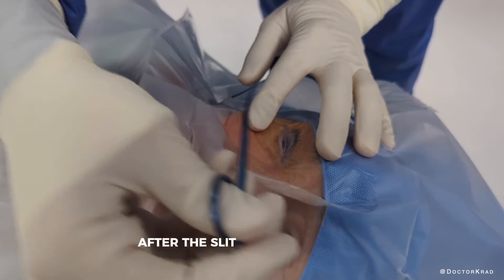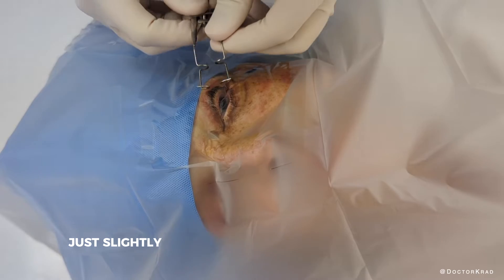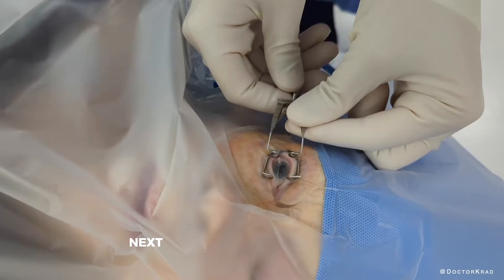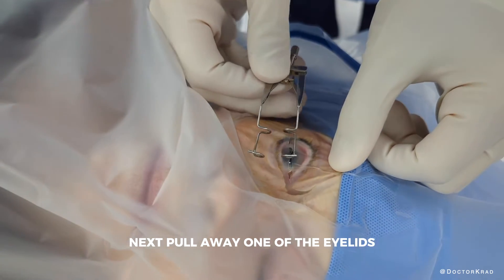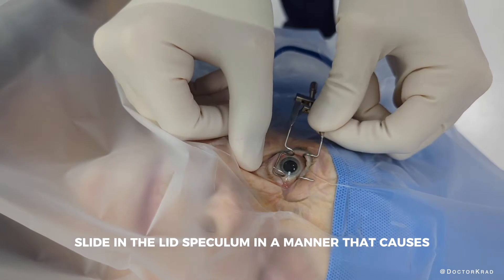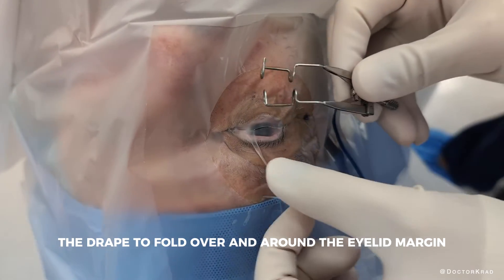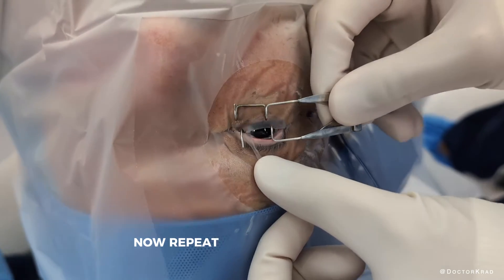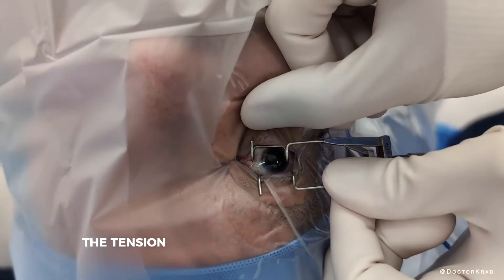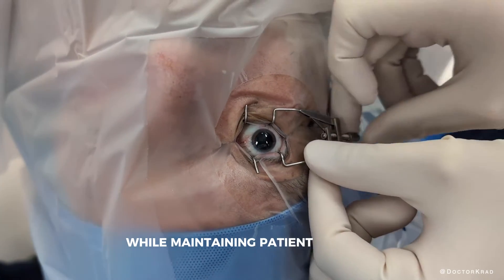After the slit has been created, open the eyelid speculum just slightly wider than the interpalpebral width. Next, pull away one of the eyelids and slide in the lid speculum in a manner that causes the drape to fold over and around the eyelid margin. Now repeat for the other eyelid. Then you can adjust the tension of the speculum to open the eyelid as much as necessary while maintaining patient comfort.